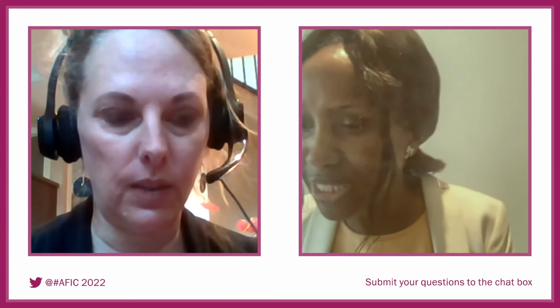So the next question says, is there a numeric value we can use to differentiate the T sign, meaning the monochorionic membrane for MCDA twins, versus the lambda sign? The person is asking if it's 2 millimeters, the distance or thickness of the membrane, whether they can use that to differentiate.